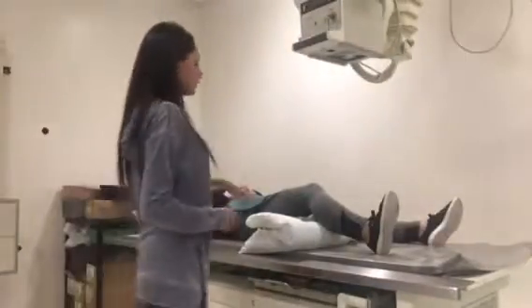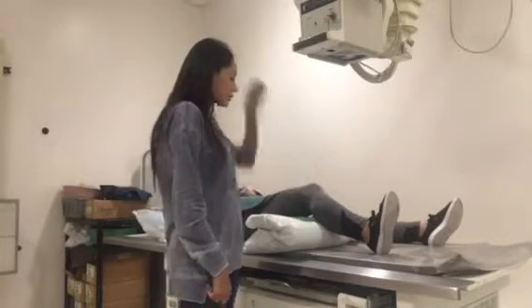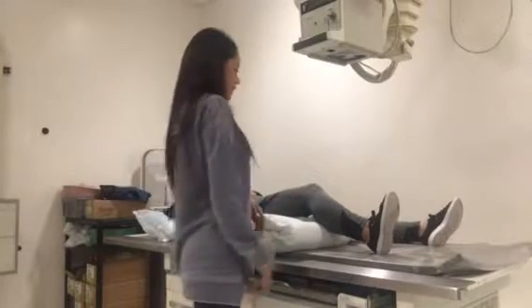Okay, so now I'm going to be doing the Béclère method. I'm going to have my patient flex her knee 60 degrees. My central ray is going to come in at the apex of the patella, half an inch below that, and my tube is going to be angled so that it is perpendicular to the long axis of the leg.